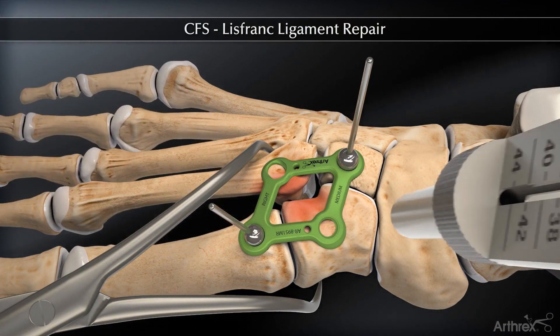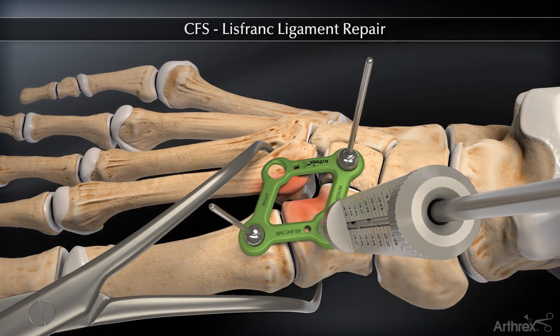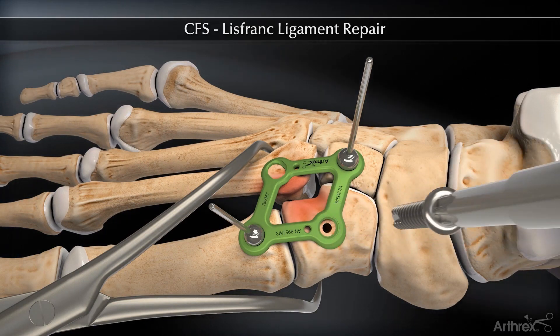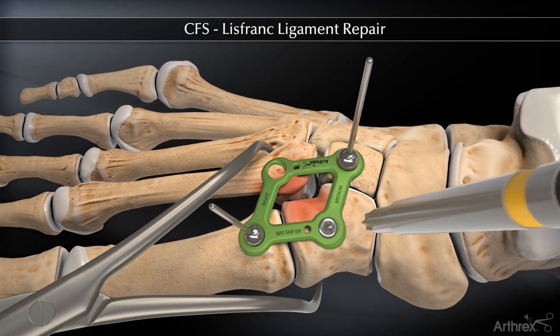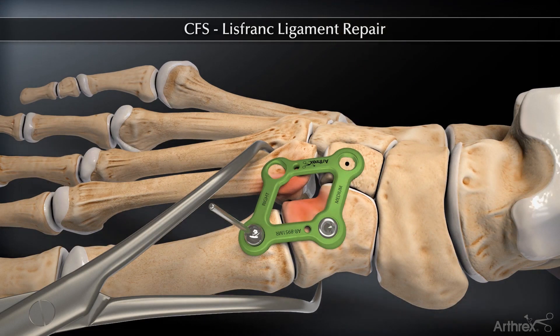The locking depth gauge is placed over the proximal medial hole and the hole is then drilled with a 2.5 mm drill. The appropriate sized 3.5 mm non-locking screw is placed to increase plate to bone contact and then repeated for the other proximal screw hole.